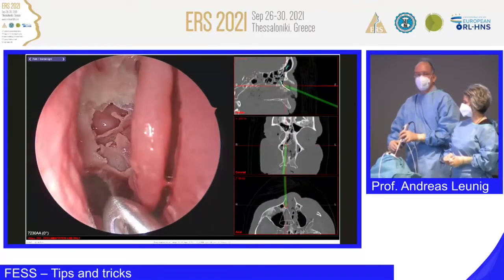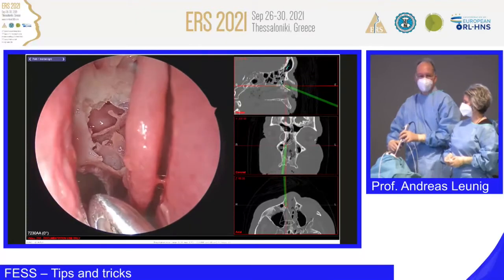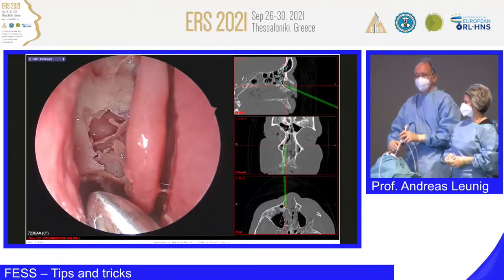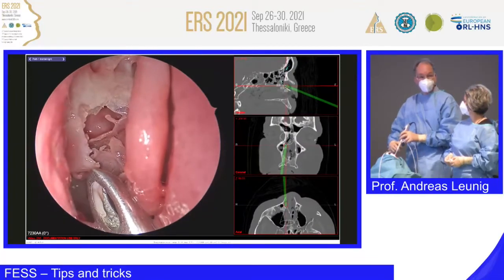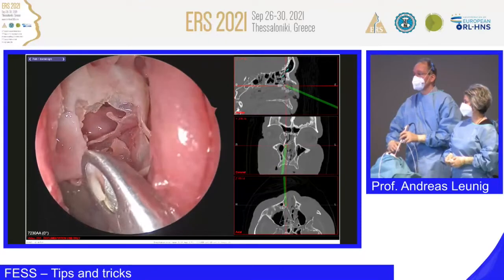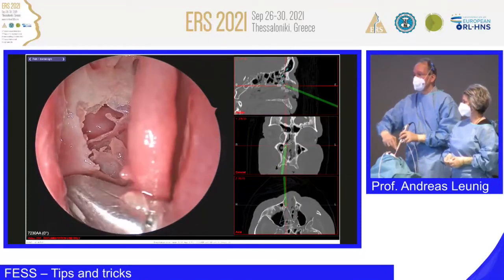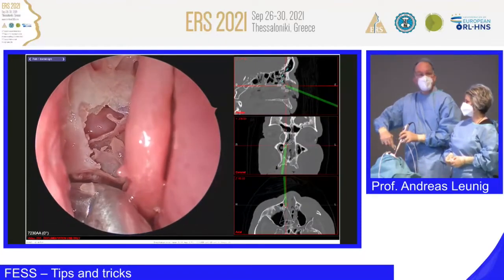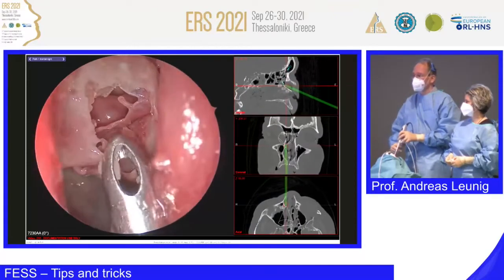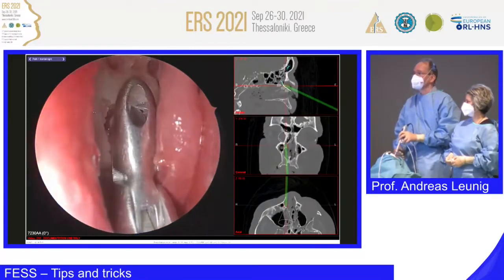Why? Because, and this could be another way to demonstrate, when you look for the maxillary sinus ostium and you are lost, sometimes this can happen, you look for the first basal lamella and the second, and usually in between these two basal lamellas, you will find the way into the maxillary sinus, but we already opened the maxillary sinus. Okay, let's go on.